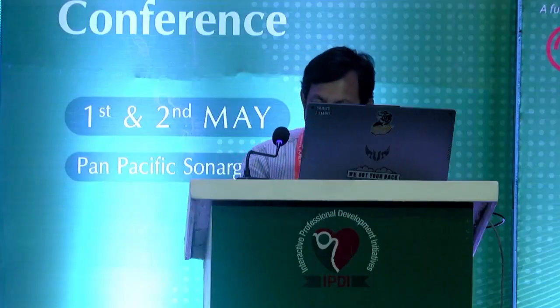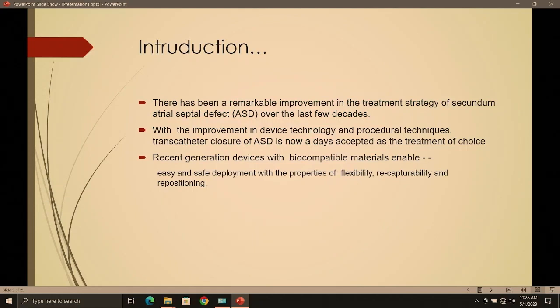I am Dr. Mohammed Shakwat, going to present on transcatheter closure of the secundum ASD: tips and tricks. There has been a remarkable improvement in the treatment strategy of the secundum atrial septal defect over the last few decades. With the improvement in device technology and procedural techniques, transcatheter closure of atrial septal defect is nowadays accepted as the treatment of choice. Recent generation devices with biocompatible materials enable easy and safe deployment with the properties of flexibility, recapturability, and repositioning.